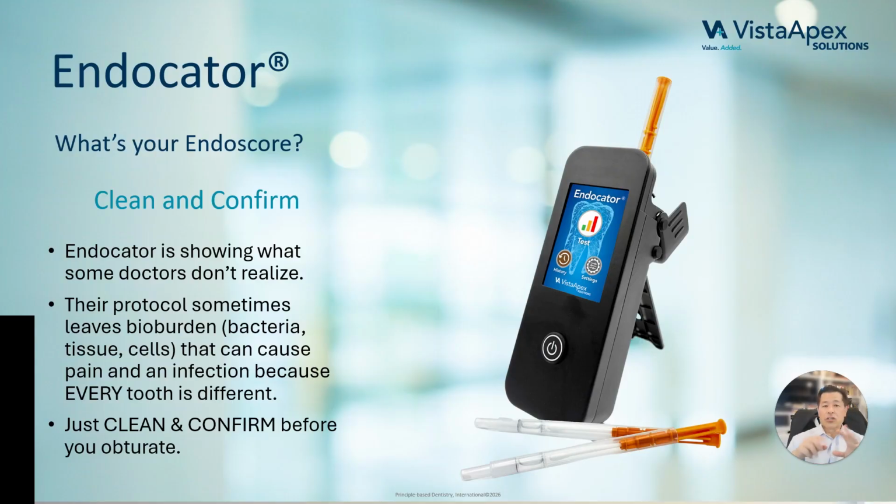And so that's going to allow us to detect how clean those canals are. If we have a high score, we've got bioburden. We've got to figure out why that bioburden is so high. But if I obturate with a high level of bioburden, there's a higher chance that we're going to have pain and the infection is not going to clear up.